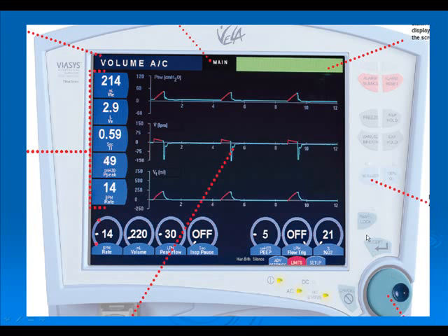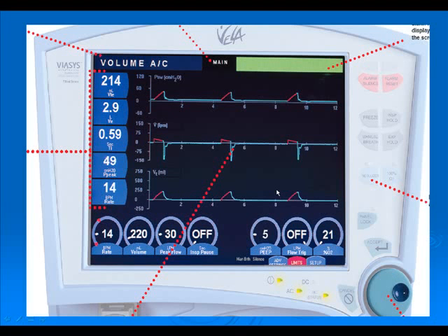Here's an example of a ventilator screen showing waveforms — a flow diagram, a pressure diagram, and a volume diagram. We have a variety of different waveforms that we can analyze. You can clearly see some of the parameters and settings displayed on this ventilator.